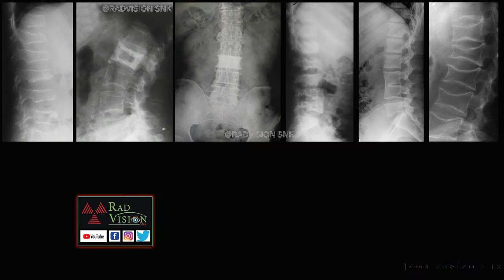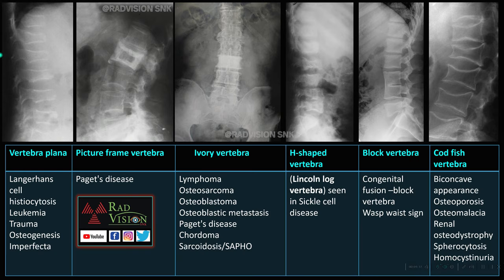Picture frame vertebra shows sclerosis around the corners of the vertebra, classically seen in Paget's disease. Diffuse sclerosis of a single vertebra is described as ivory vertebra, seen in lymphoma, osteosarcoma, osteoblastoma, osteoblastic metastasis, Paget's disease, and chordoma.